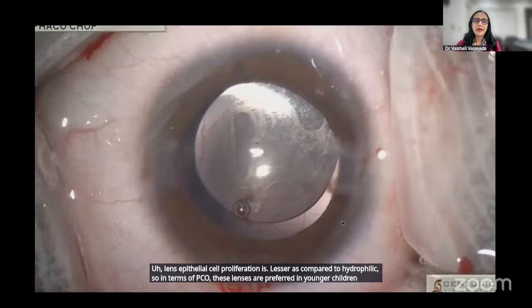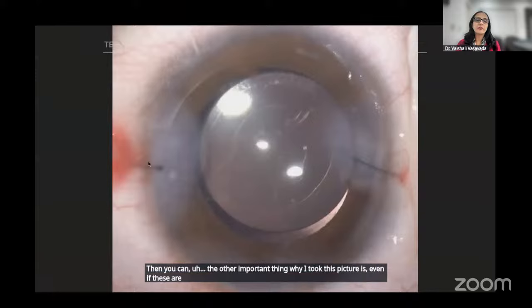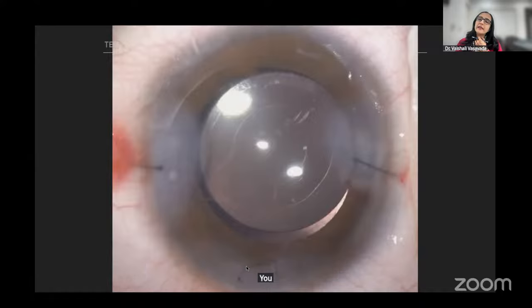So once it is in the bag, the other important thing why I took this picture is even if these are 1.1 mm incisions, they should be sutured. And this one I've taken a box suture. So children rub their eyes and you cannot control all this. So please take sutures. You could take Vicryl if the child is not likely to follow up.